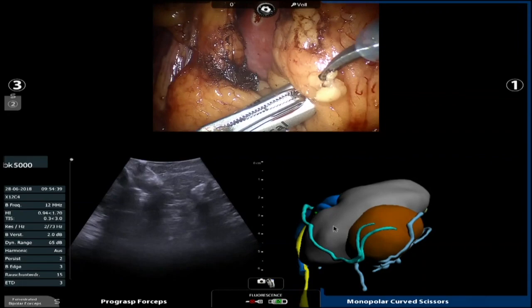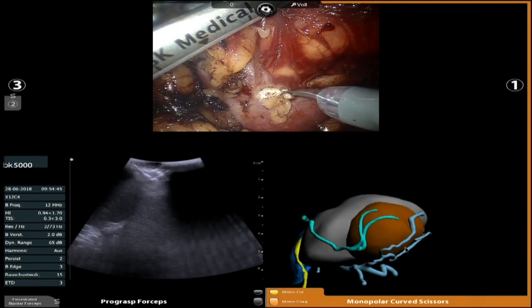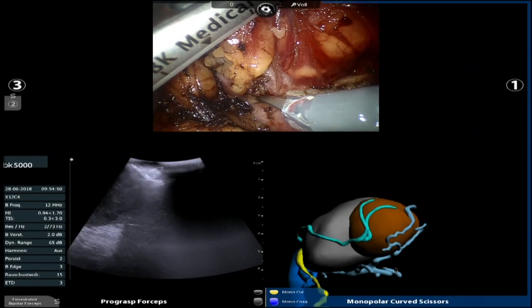Looks like a big cut. Was that protrusion right at the midpoint of the tumor? That protrusion deeper down to the sinus? It is. It's exactly a deep portion of the tumor. And I'll show you again here before I come out.